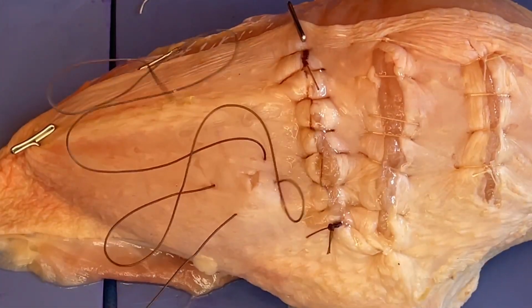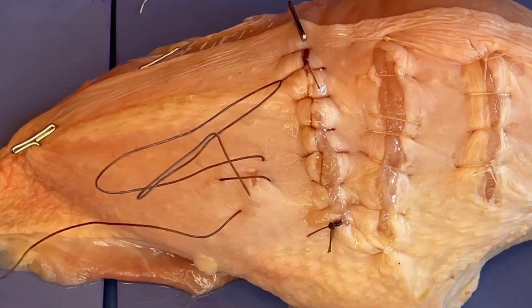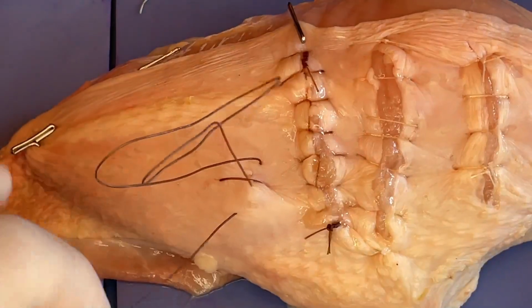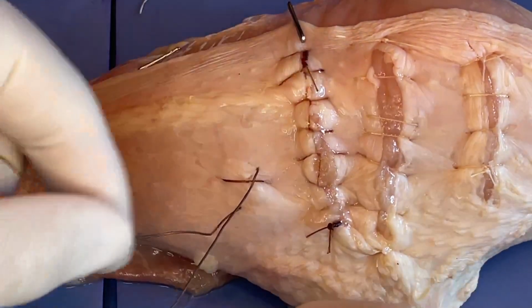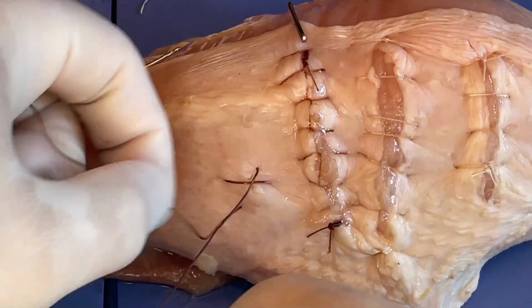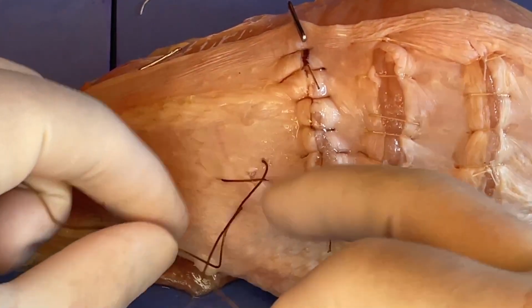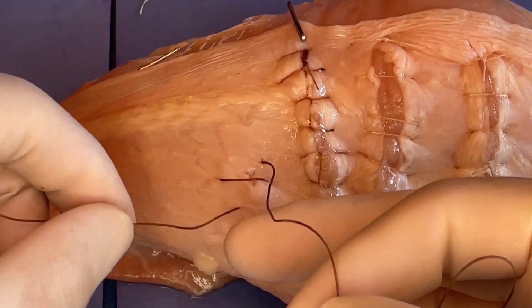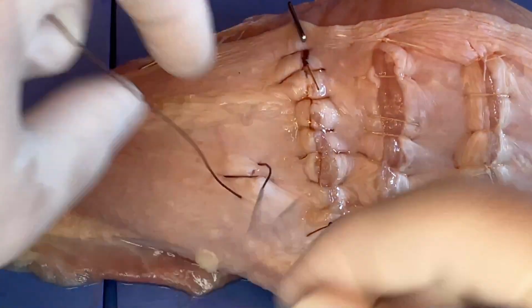And then as we tighten this down, what we see we've got is a nice area of compression, because now as we tie this, we've got kind of that X or 8, so figure of 8. But we've got compression really surrounding that area of bleeding. So no matter which direction those vessels are coming in from, or if they're coming up from a little bit deeper, we've got good compression there.